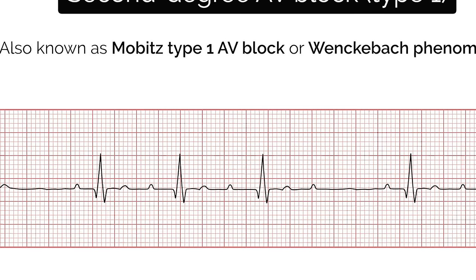Third degree or complete AV block occurs when there is no electrical communication between the atria and ventricles — the atria and the ventricles are functioning independently. If the PR interval is shortened, this can mean one of two things: the P wave originates from somewhere closer to the AV node so conduction takes less time, or the atrial impulse is getting to the ventricle by a faster shortcut instead of conducting slowly across the atrial wall. This accessory pathway can be associated with a delta wave, which we will discuss next.